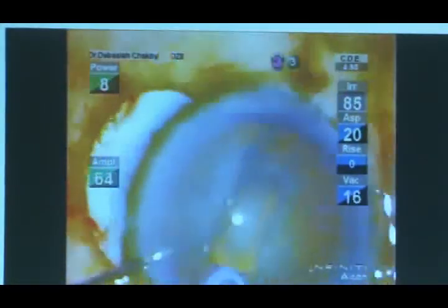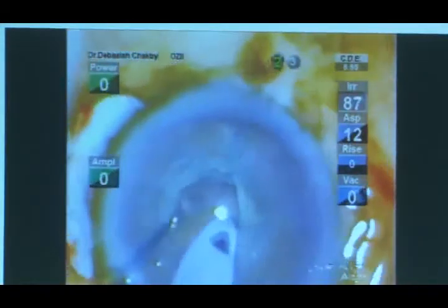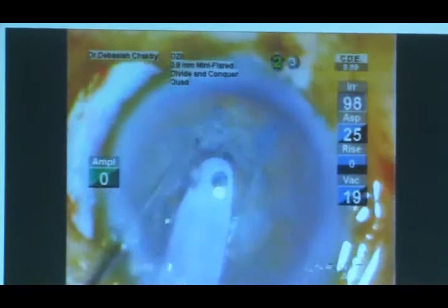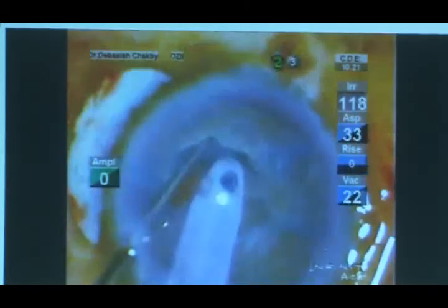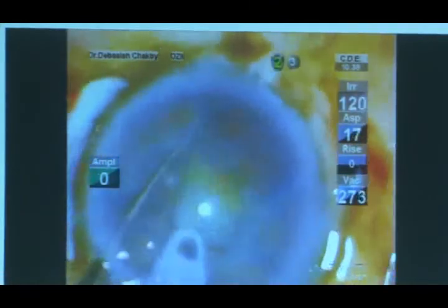A clear corneal incision is made and the phaco is done. One can use whatever technique one is comfortable with, maybe stop and chop, maybe direct chop, maybe divide and conquer method. But we should be very careful not to cause any damage to the posterior capsule, because if there is vitreous prolapse, the success of a phacotrabeculectomy definitely comes down. So we do a chopping of the nucleus and then complete the phaco in an uneventful way.